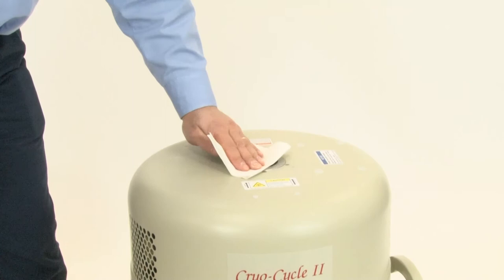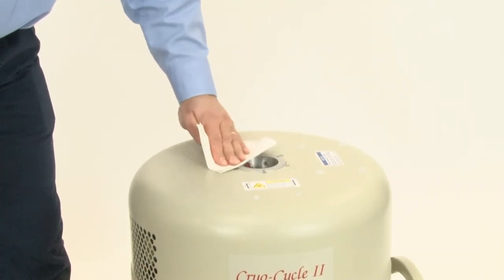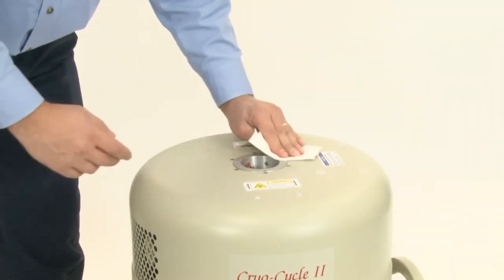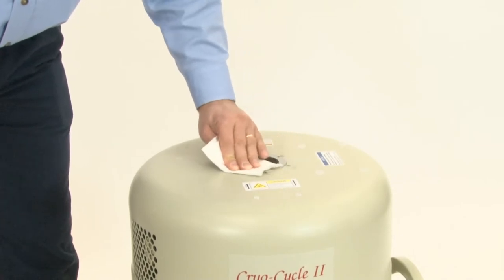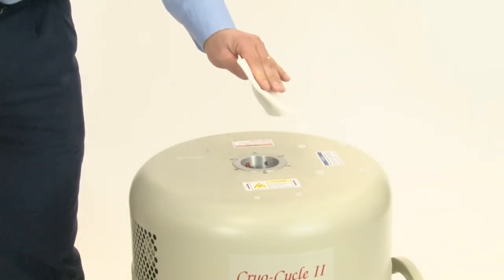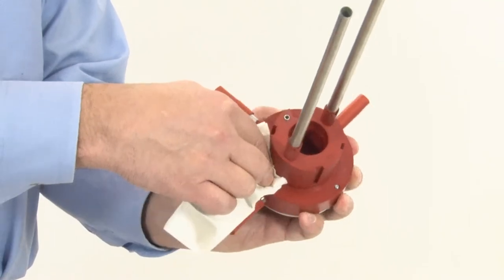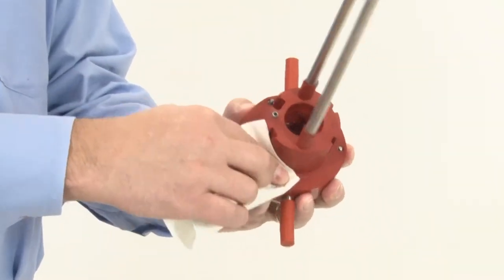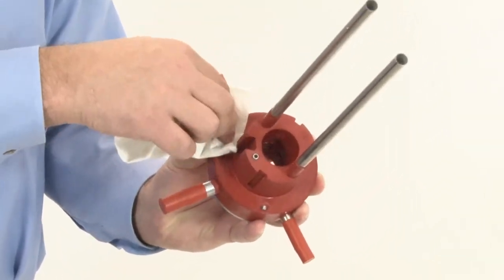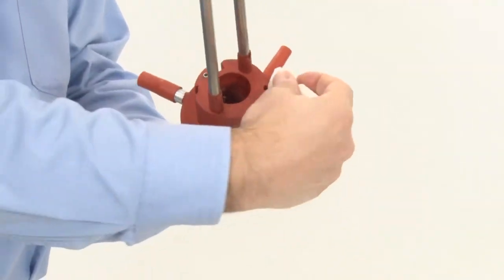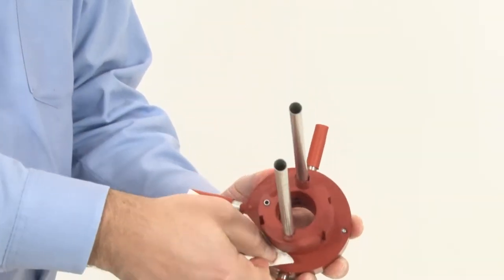So the first thing we do is we take a towel and clean off the surface of the cryocycle where the collar will be installed. The next thing you do is you take the collar and do the same thing. You clean off the mating surface of the collar. Make sure there's no debris, dust, or contaminants in the way for making the seal.